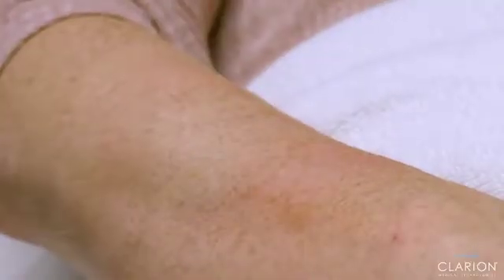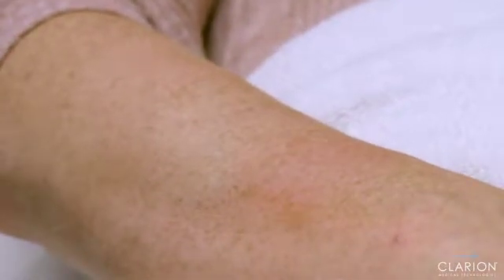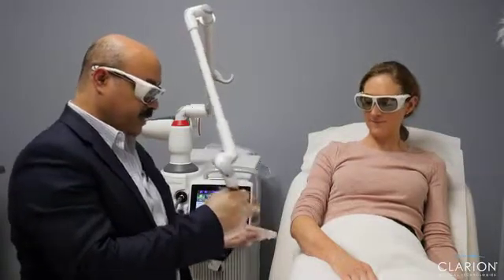Can you see the difference? Yeah, I can. Okay. So do you feel it's too much burning? I think we can do one more. One more? Okay. That would be much better. Yeah. Okay, so we'll do the third and the last pass now.